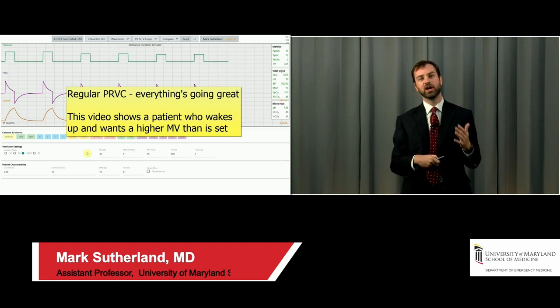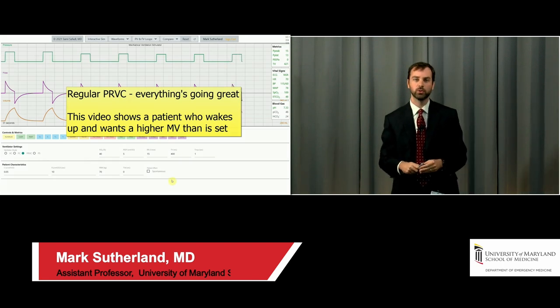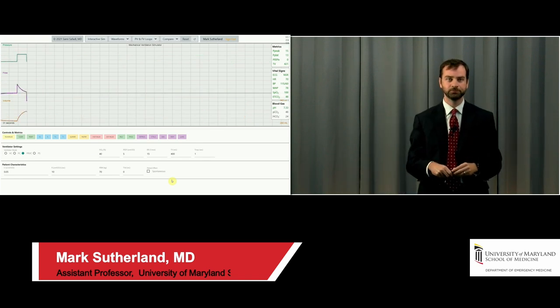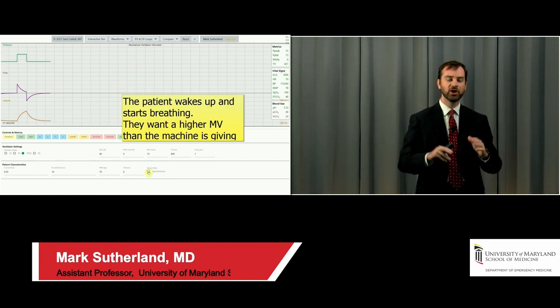PRVC doesn't respond well to air-hungry patients. So we're going to start the video playing, and I'll walk you through what we're seeing here. I've also got some text on the screen, and it will pause when the text shows up so you guys have a chance to read it. So this is run-of-the-mill PRVC, no problems, patient sedated, paralyzed, whatever.